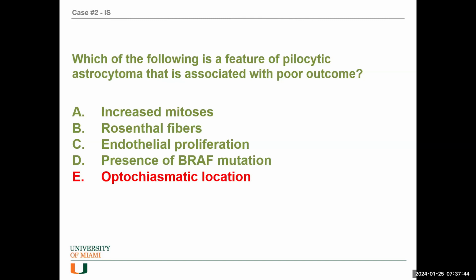Dr. Gultekin had mentioned craniopharyngioma, so that's something to be aware of. There are also some leukodystrophies that can do it. For example, if this was a really young child who had degenerative symptoms, no posterior fossa mass to give you a pathology, and then there's a bunch of Rosenthal fibers, you can also consider a leukodystrophy. Alexander's disease does this as well. So those are the Rosenthal fibers: pilocytic, craniopharyngioma, and then a leukodystrophy, Alexander disease.